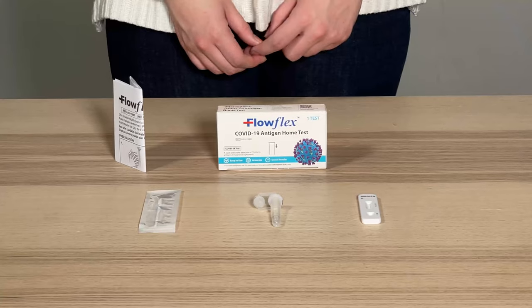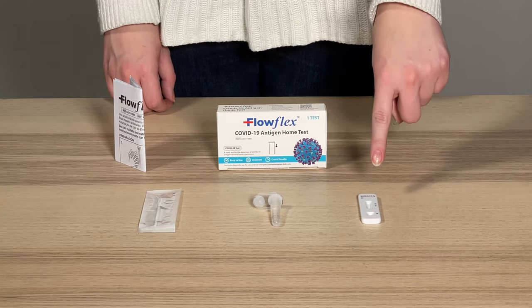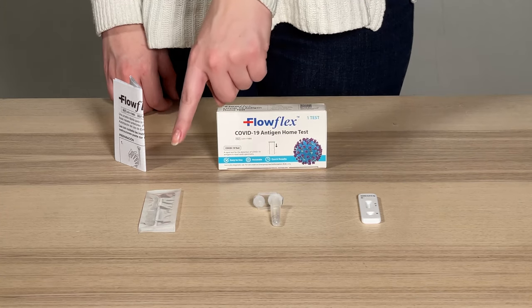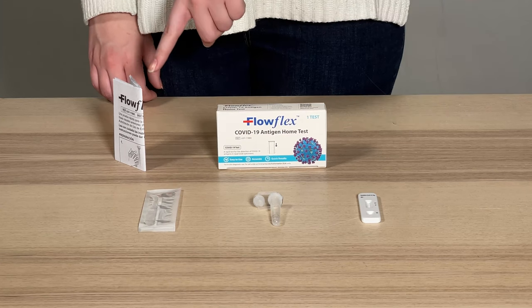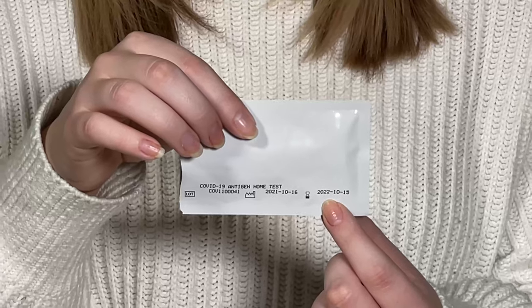Before you start, make sure your hands are thoroughly washed and dried. Read the instructions for the FlowFlex COVID-19 Antigen Home Test. Check your kit contents and make sure you have everything. You should now have your test cassette, extraction buffer tube, a disposable nasal swab, the tube holder (which is your box), and the package insert. Check the expiration date on the foil pouch.